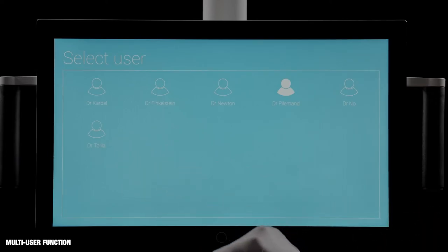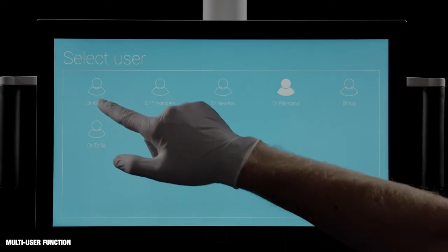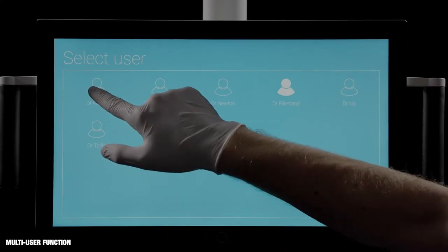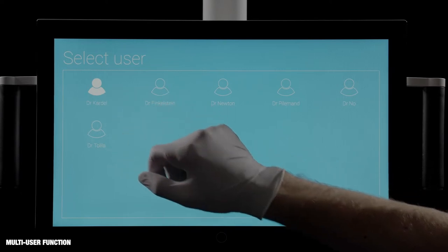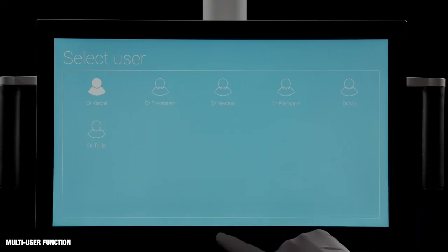Each user has a profile that stores individual settings of instruments, unit and patient chair. All user profiles are accessible from all units in a network.